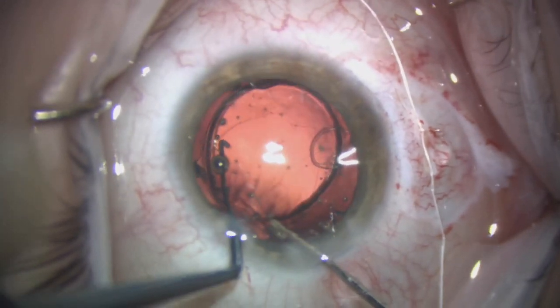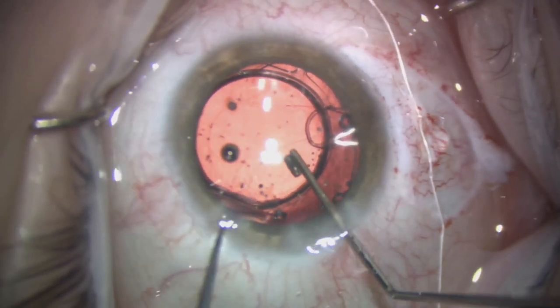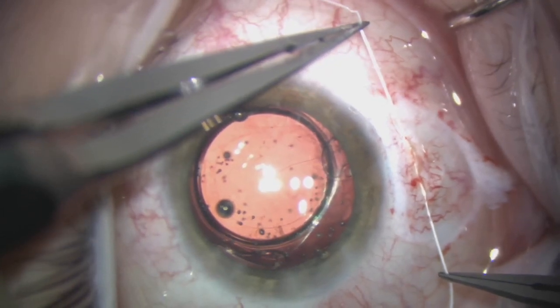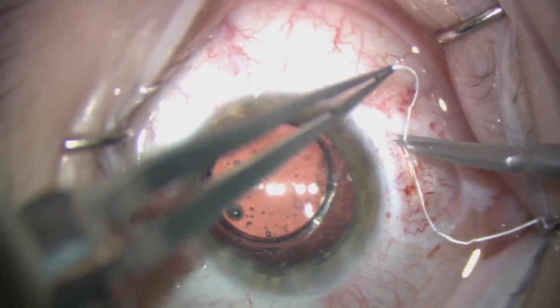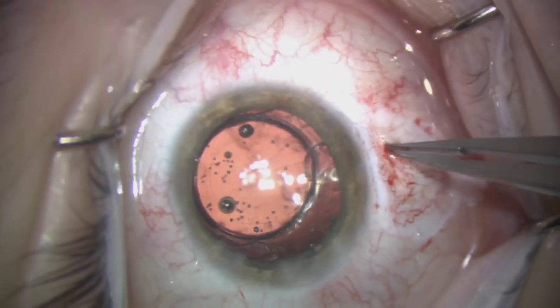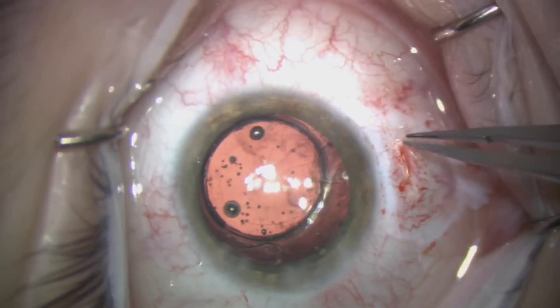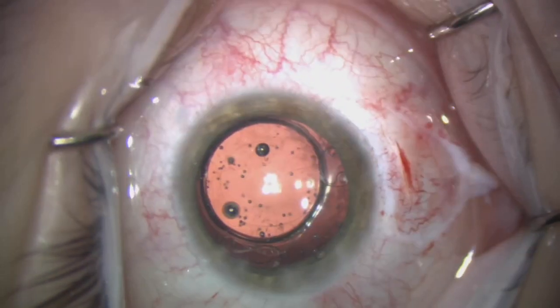Once the lens is well positioned, as you can see here, we centre the lens up and tighten the suture, place our final locking knot, and trim the edges. We then push the knot into the eye and ensure it is nicely buried, as these can erode if this is not done.